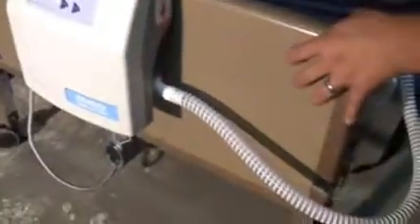After all repairs have been made, simply reconnect your air tube to your air unit and power it back on to reinflate your low air loss overlay.